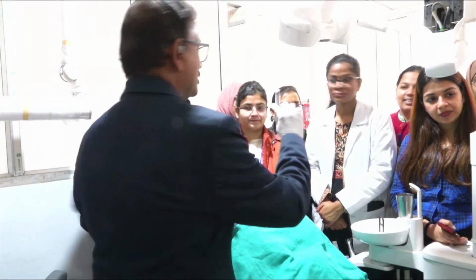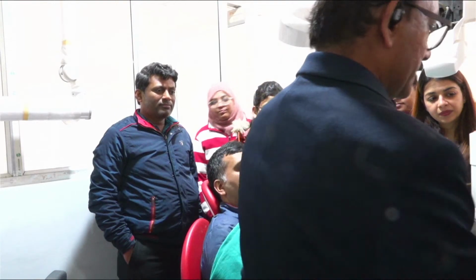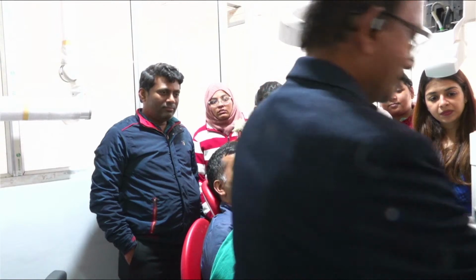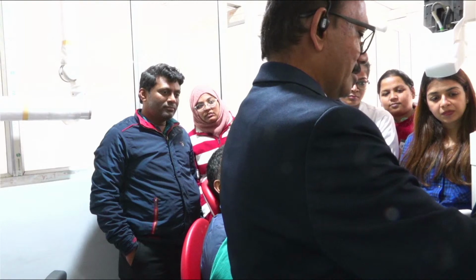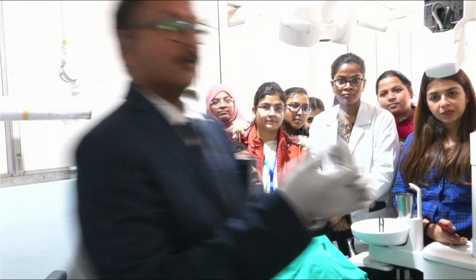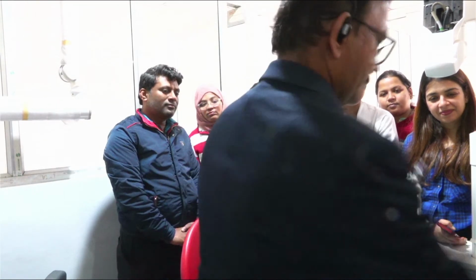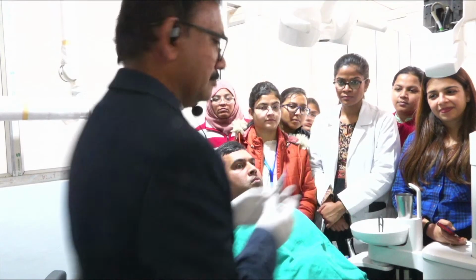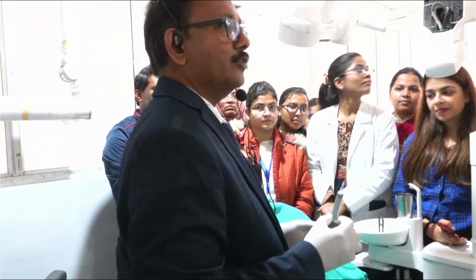See, this is what I have taken more. Actually, this much is not required because it is a single pocket. I will show you how to save on the dye also now. Exactly. Enough. This much is more than enough, right? Not mirror. Somebody should stand here, a representative from the department.